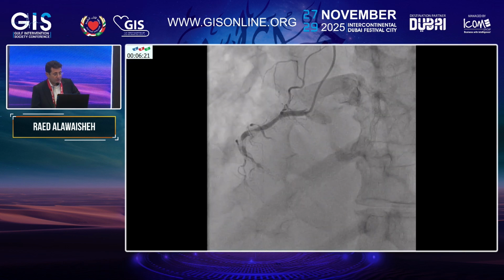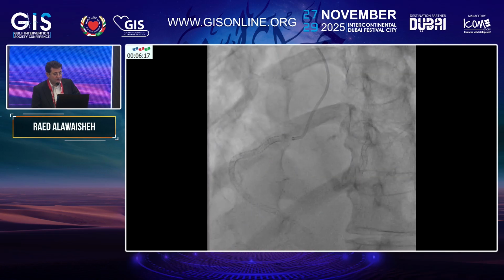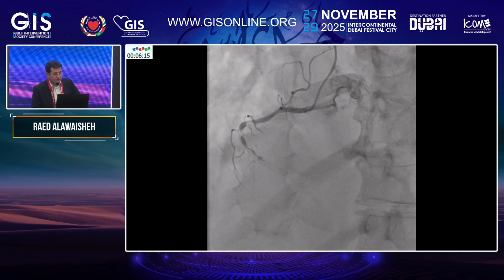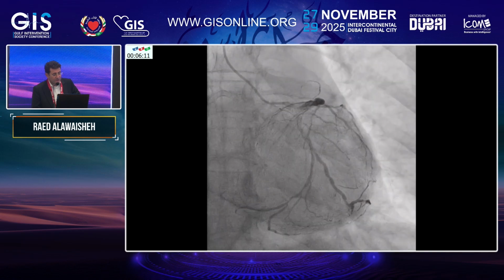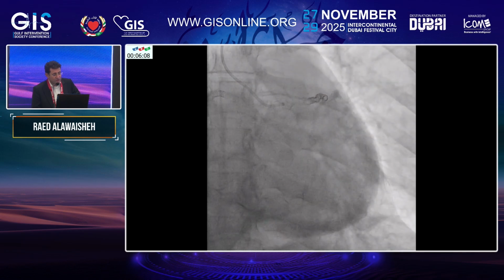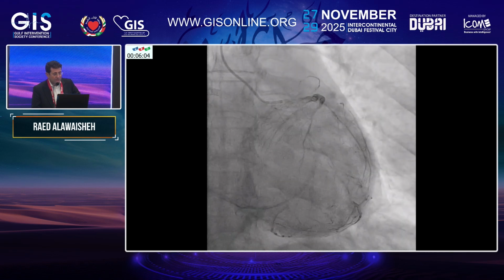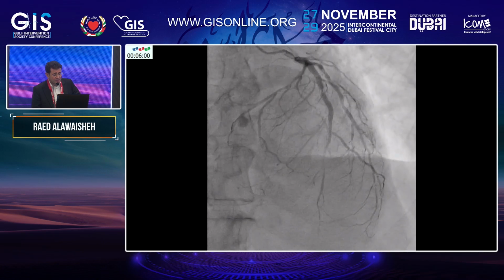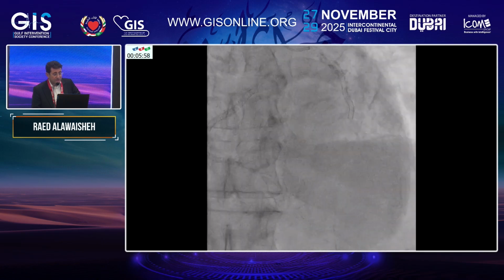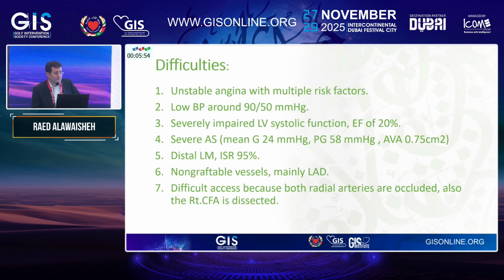This is the RCA, how it looks. You can see the stent there with distal restenosis and no flow to the distal vessel. There is significant in-stent restenosis in the left main, and lesions in the circumflex, and the most significant is that the LAD is severely diseased in the mid segment and distally. So we have difficulties in this case.